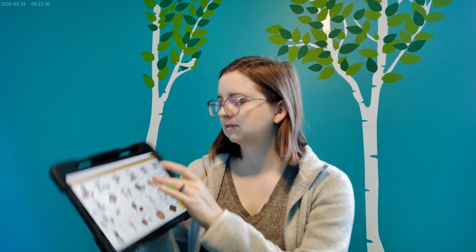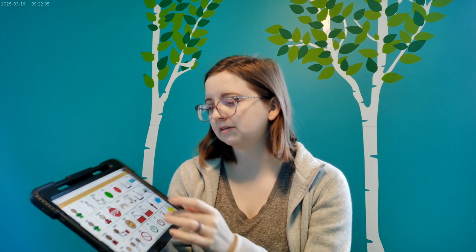Our first strategy is modeling during everyday routines. One of the easiest ways to model AAC is by incorporating it throughout your daily routines. You don't have to set aside a special AAC time, just naturally do it as you go throughout your day. Here are a few examples. During mealtime, you might model words like eat, more, yummy.